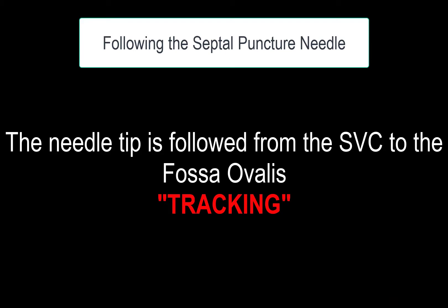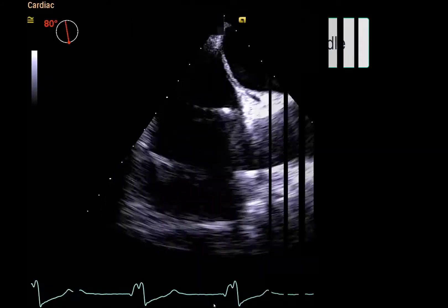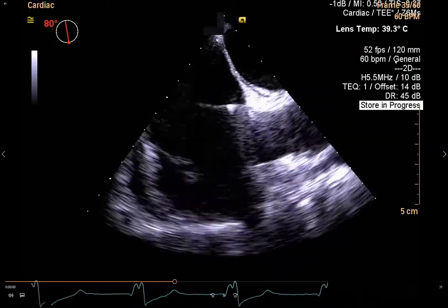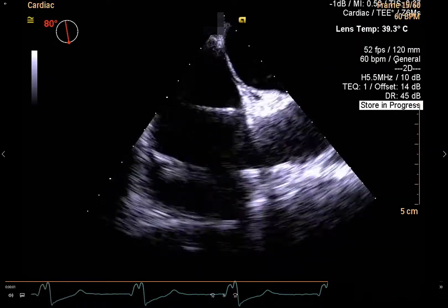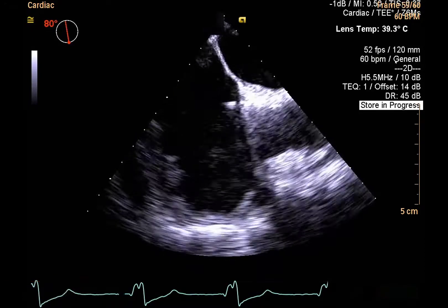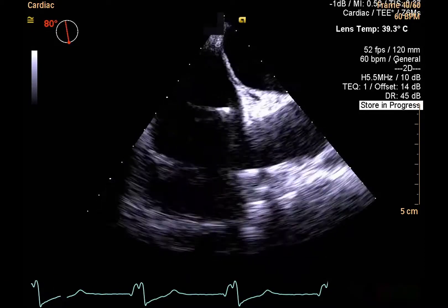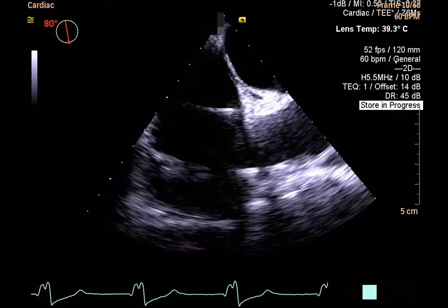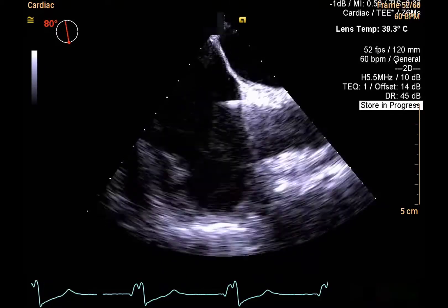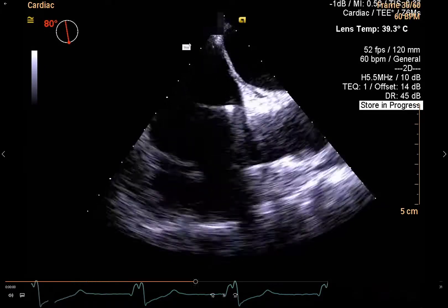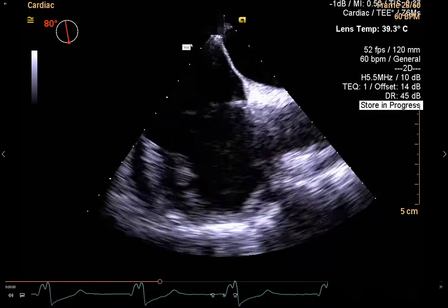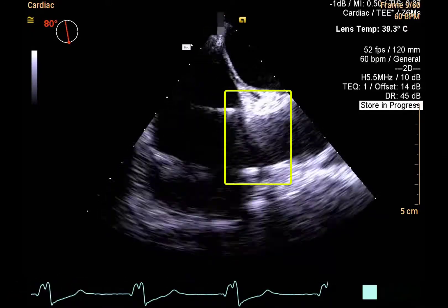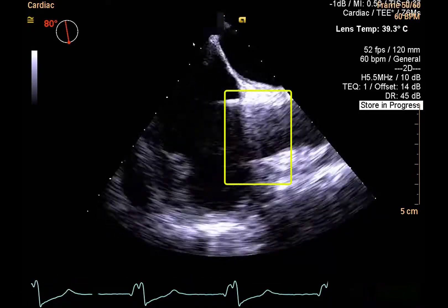During the tracking step, the septal puncture needle tip is tracked from the SVC to the fossa ovalis. It is important to identify the needle tip and continuously track it during motion to prevent inadvertent septal injury from misidentification of the shaft as the needle tip. The best way to achieve this is to track the acoustic reverberation artifact of the needle tip during its motion.